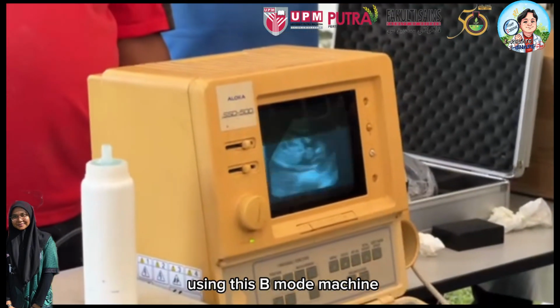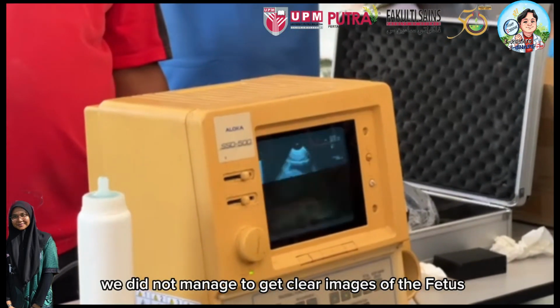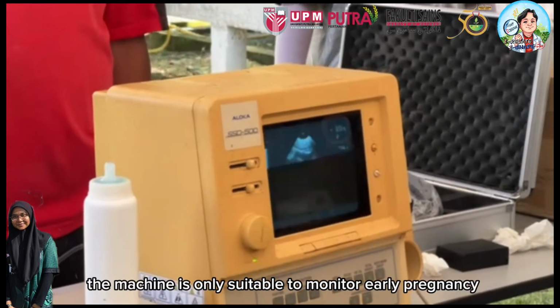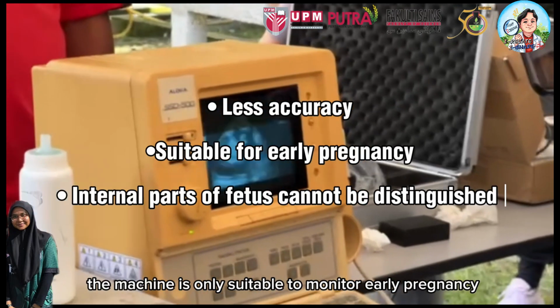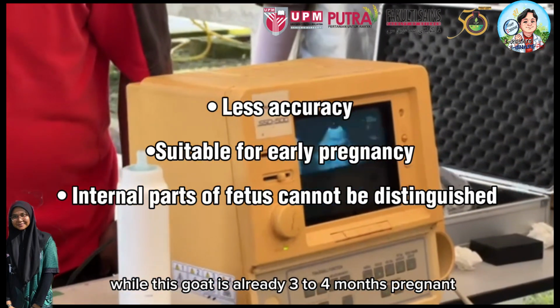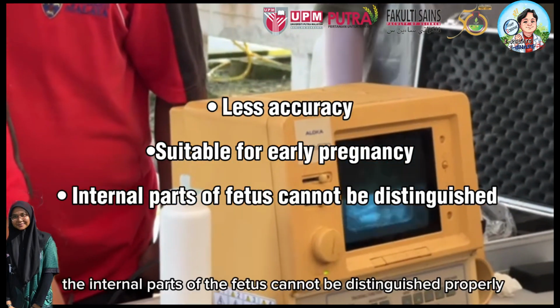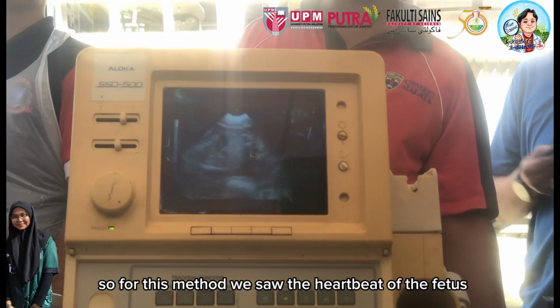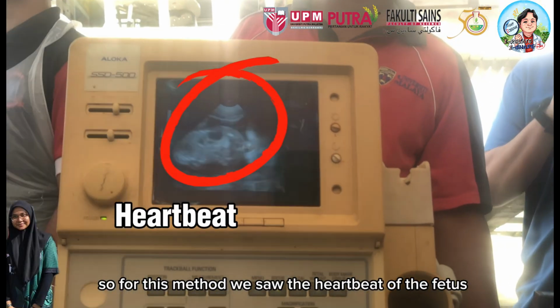Using this B-mode machine, we did not manage to get clear images of the fetus compared to the first B-mode machine, and this is because the machine is only suitable to monitor early pregnancy, while this goat is already 3 to 4 months pregnant. Therefore, the internal parts of the fetus cannot be distinguished properly. So for this method, we saw the heartbeat of the fetus.